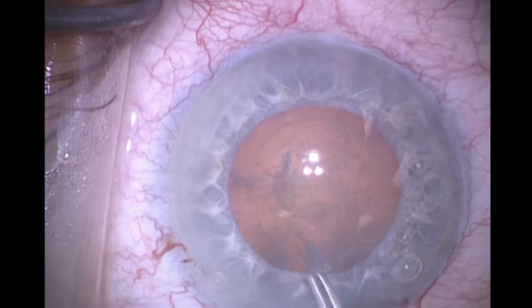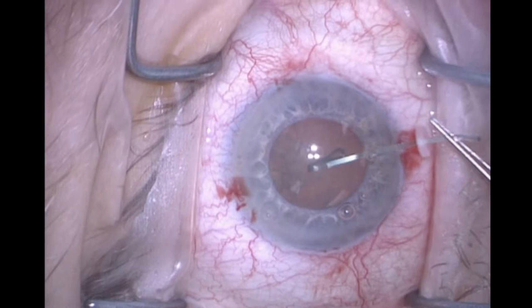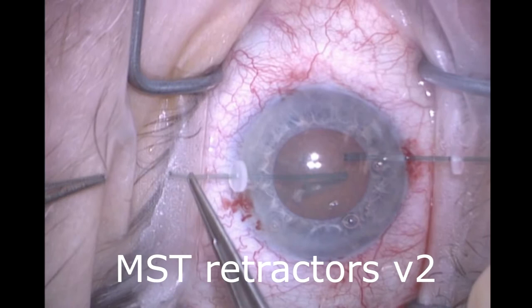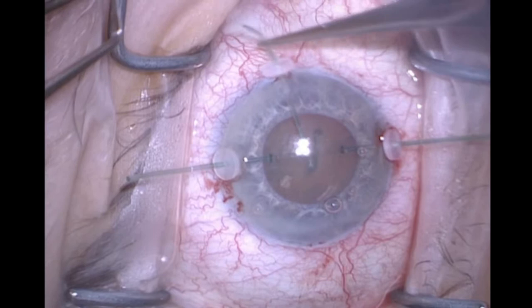I encounter difficulty when I try to rotate the nucleus, so in go the MST capsular tractors. This is version 2, which I had a part in developing. They are shorter than version 1, so they give a little more support to the capsulorhexis edge, but they also support the peripheral equatorial capsule. They are disposable.